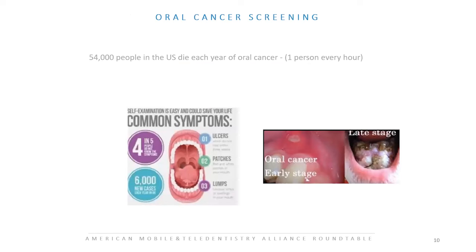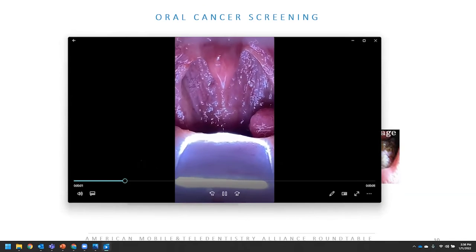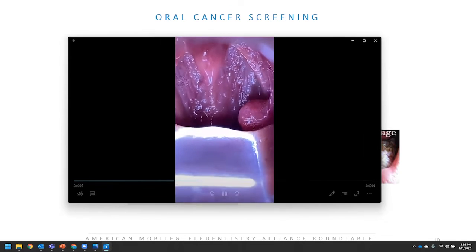As Sarah was saying that she was using it for oral cancer screening. So moving into 2022, realizing the benefits of the TelScope, and that it's not just going to be an individual capture like an intraoral camera. We're doing a palpable and visual oral cancer screening on all of our patients. But I love the idea that this is going to be a capture video. We can use it with Wi-Fi, without Wi-Fi, and just get a lot more detail.